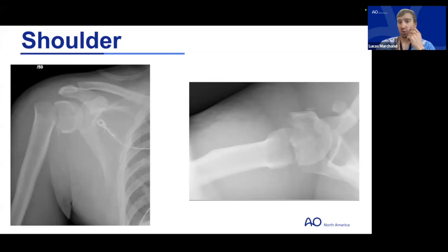Kellum, is there anything you would add to her description, or are you satisfied with everything she said? I'm really satisfied with everything she said. What is really nice about the way she said it is she focused on the injury. In the back of your mind, what all of us on the panel are doing is we looked at everything else on the image, and I know you're going to get to that when we get to the shoulder, but we looked at everything else that was negative.